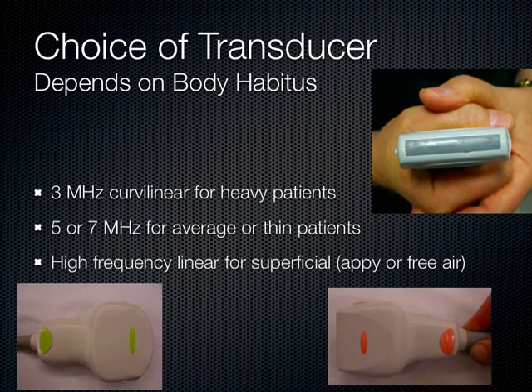In this quick demonstration, generally speaking, to visualize the intestines, you want to use the linear probe. Now, I know what you're thinking: the linear probe's for superficial structures, and that's high frequency. However, when you use this, you're going to use a compression technique to look at the intestines. You're going to push down on the abdomen using that linear probe.